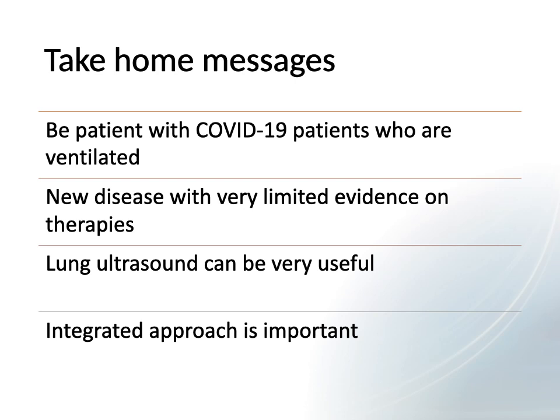So I will finish by my final take-home message. Be patient with COVID-19 patients who are ventilated because we know that these patients take a bit long on the ventilator. It takes a bit of time for the lesions to heal. So around 10 to 14 days is our experience for them to be ready for weaning and extubation. And therefore, lung ultrasound is very useful to monitor the improvement in aeration before extubation.